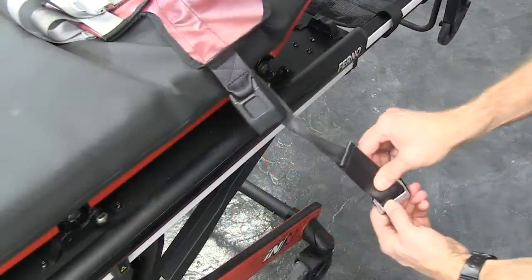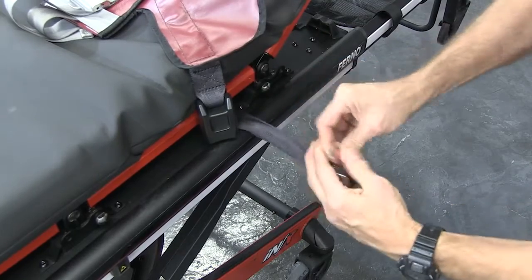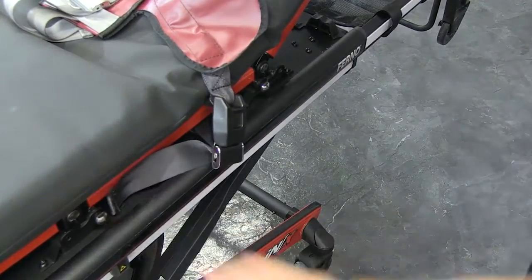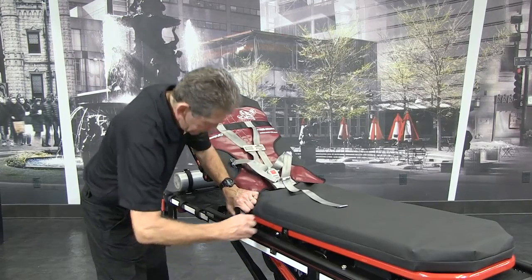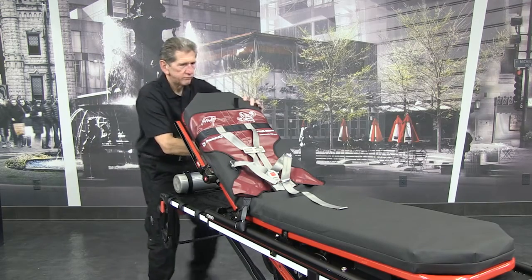Repeat this step with the other mainframe strap. You may need to adjust the PDMATE's position on the NX to accommodate the patient properly. After doing so, tighten the backrest strap and both mainframe straps.